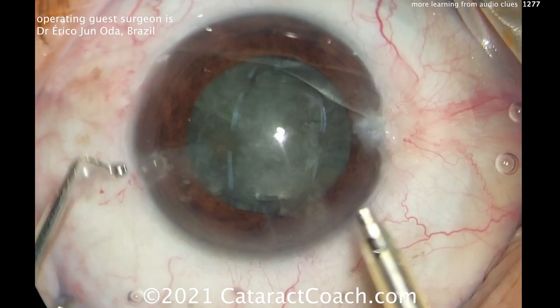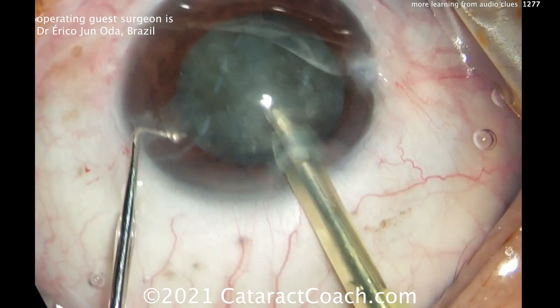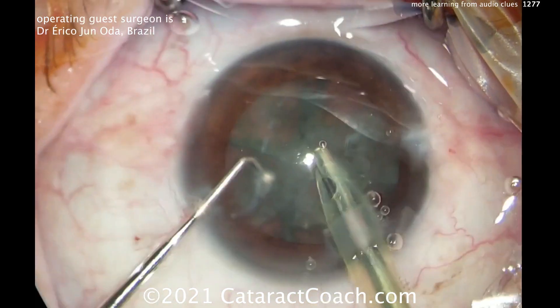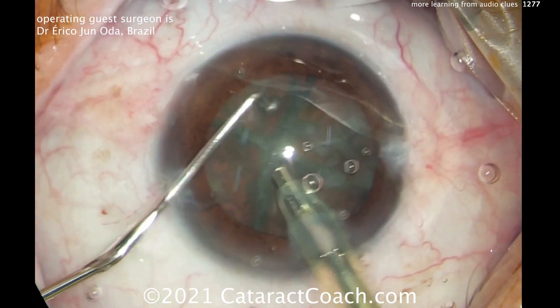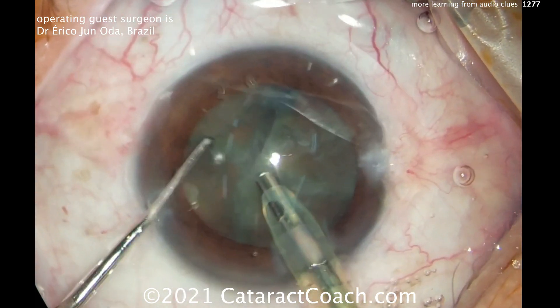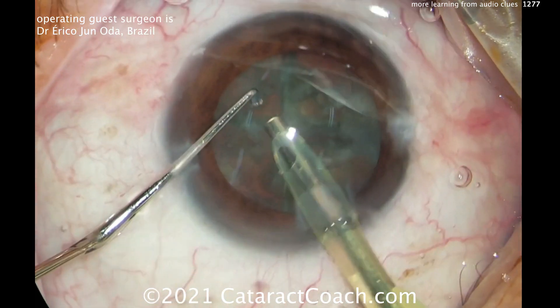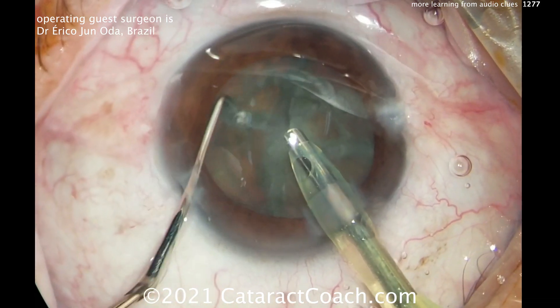Especially in the technique here, the sound of high vacuum — that high vacuum is the clue. So here now, putting the FACO probe inside the eye. You're going to listen to the high vacuum. So that's low vacuum, and now when it goes high vacuum, listen to the sound. He's going to go into the nucleus, get one of these pieces, and the vacuum level is going to rise.